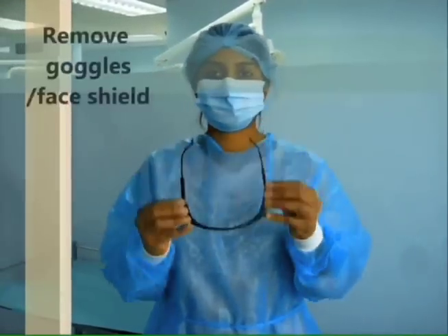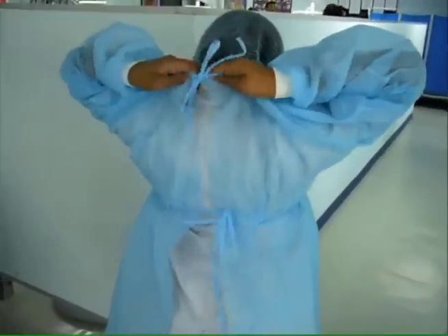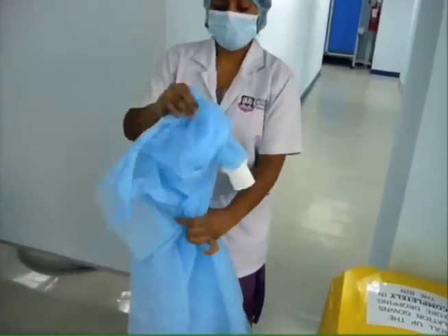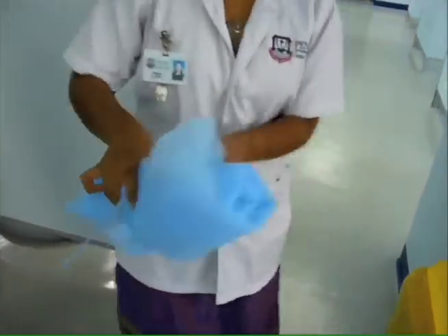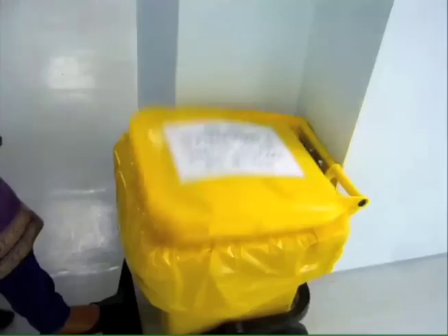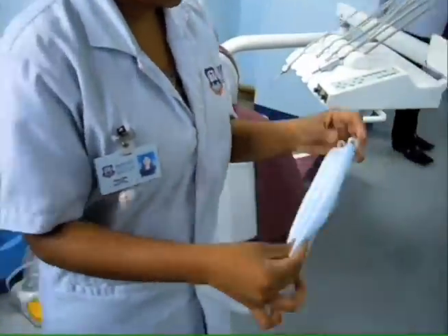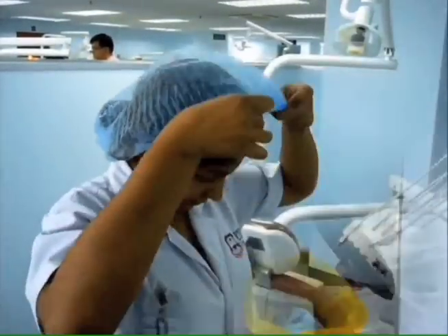After degloving, remove goggles or face shield. To dispose the barrier gown, rip the strings off and remove it inside out without touching the outer surface of the gown. It is then rolled up and disposed into the clinical waste bin. Remove the face mask, fold it inside out and dispose into the clinical waste bin. Do the same for the head cap.